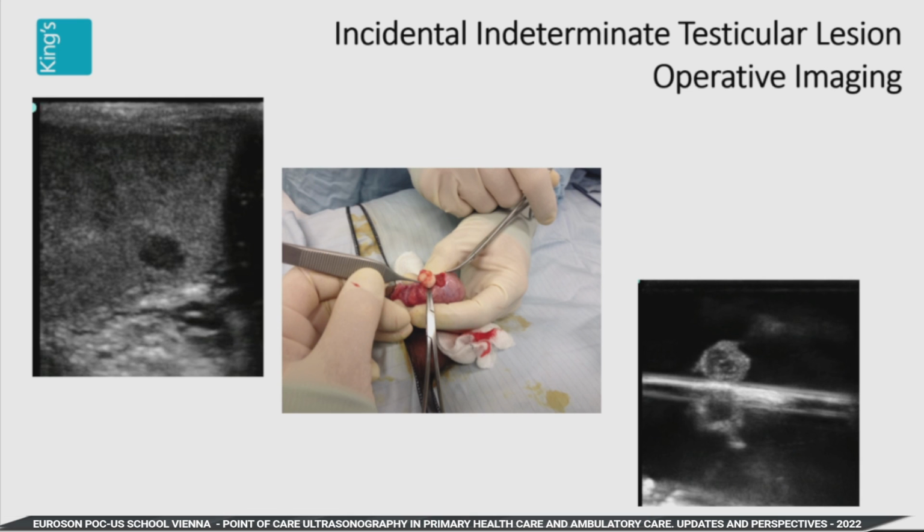Most important thing is to put that specimen into a water bath and look at it with your ultrasound to make sure they've taken that tumor out. Then you do a frozen section. And then you can proceed at that time to leaving everything there and come away if it's Leydig cell hyperplasia, or if necessary, proceed to an orchidectomy at that stage because it is a malignancy. So this is how we use our multiparametric ultrasound imaging. But you can just watch these patients.